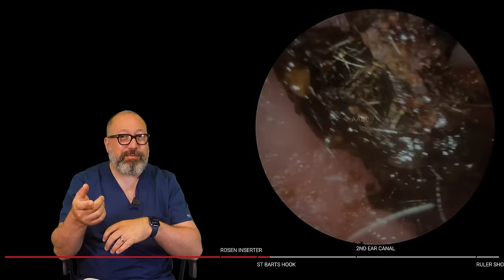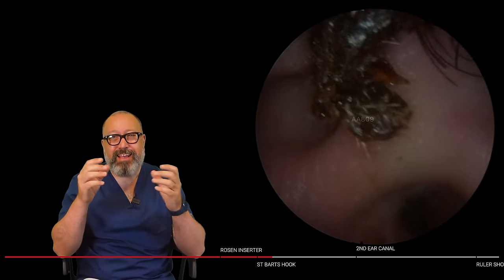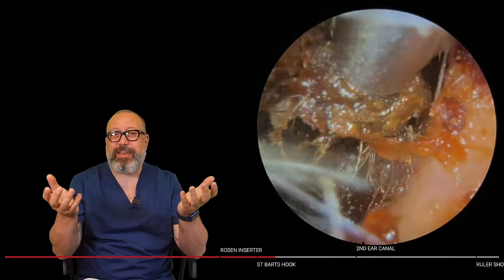I did this removal as well, guys. Probably it was a couple of weeks ago, and I can't remember it. But look at the size of that plug. And that's on top of, and there's still more in there. That's on top of what we've already taken away.